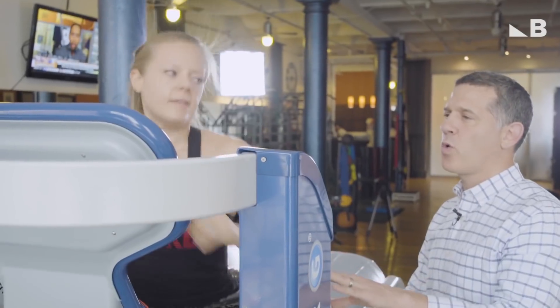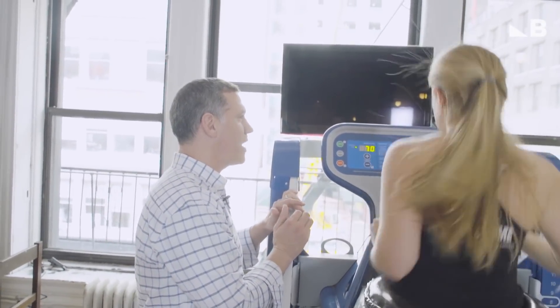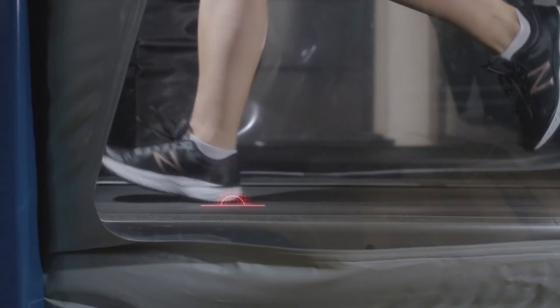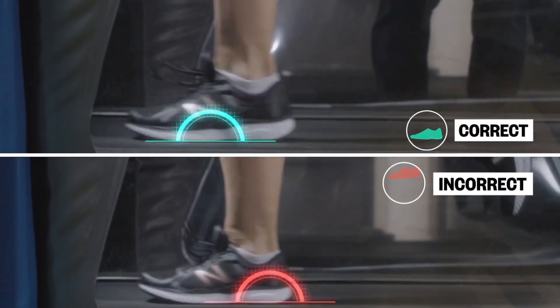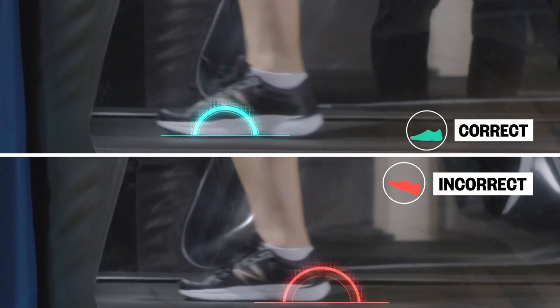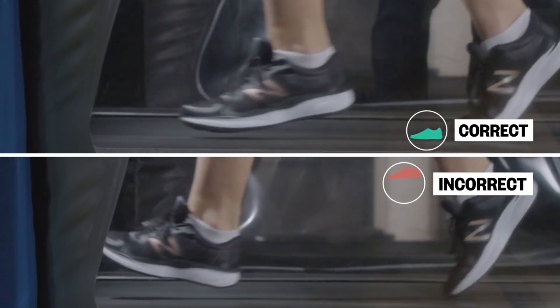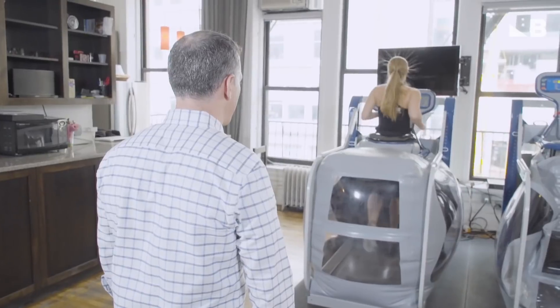Once you get the hang of that, I want to start working on where you're striking on your foot. You typically land with a heel strike — your heel is the first part of your foot that hits the ground. I want you to start thinking about landing more midfoot, so three quarters of the foot from the ankle bone up is landing as you land. That's going to allow you to land below your center of mass instead of out in front. It makes me shorten my stride. Shorten your stride a little bit — exactly. That's good, it's exactly what we want.